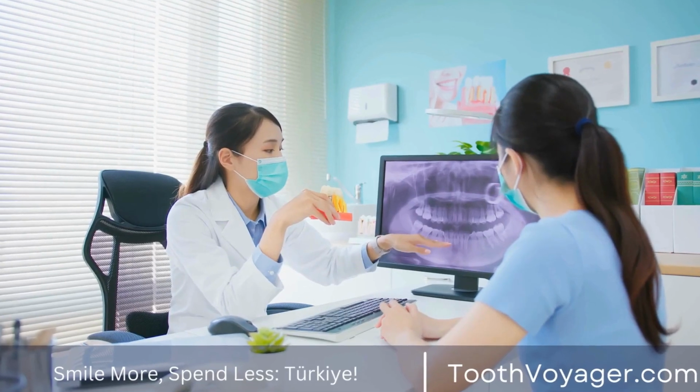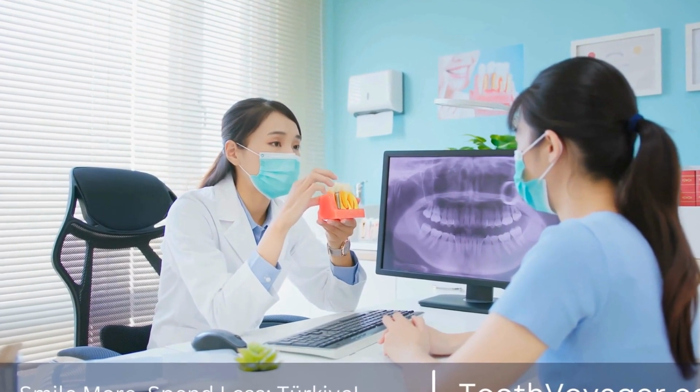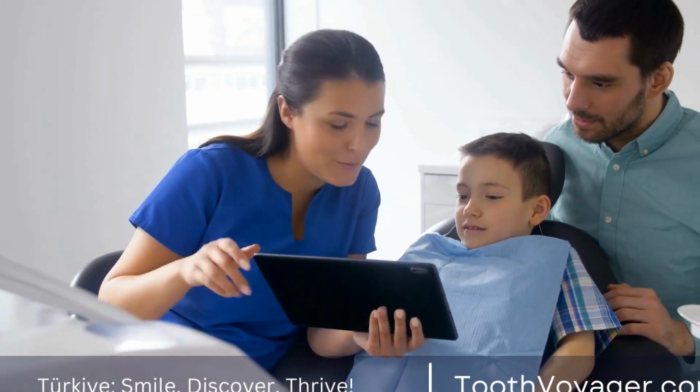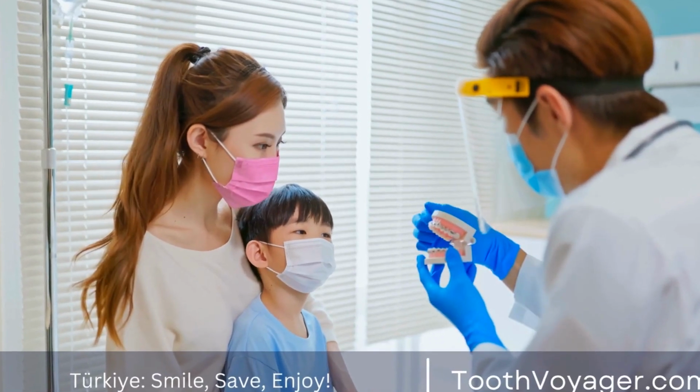Crowns made of dental material are customized caps which are placed on top of the tooth in order to protect and secure the tooth. They are made to match the size and shape of natural teeth. They give the patient a natural and seamless smile.